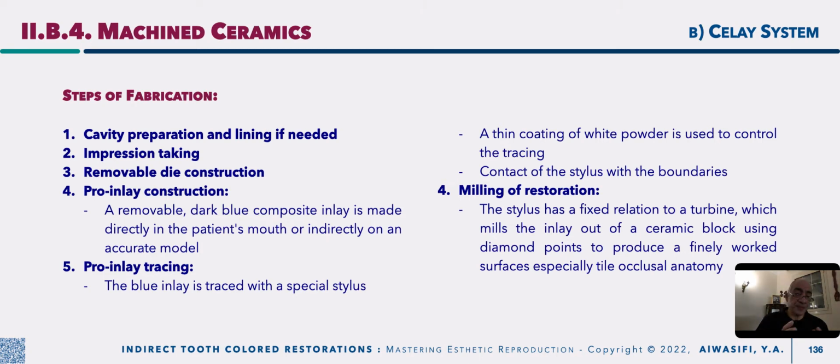Then removable die construction, and on this removable die we construct a blue inlay from blue composite resin. It's not from wax, to avoid any scratches from the force of tracing. It should be hard enough to withstand the force of tracing without changing the dimensions or the created anatomical form.